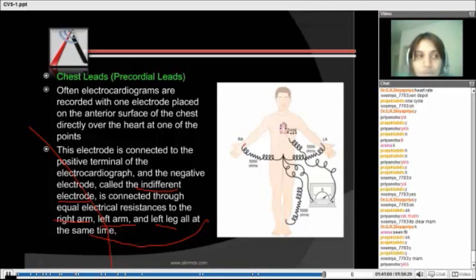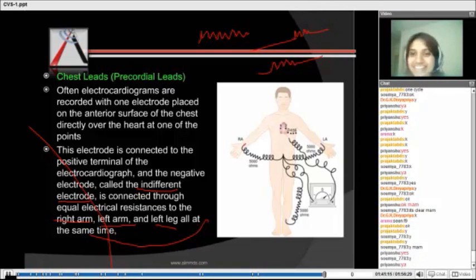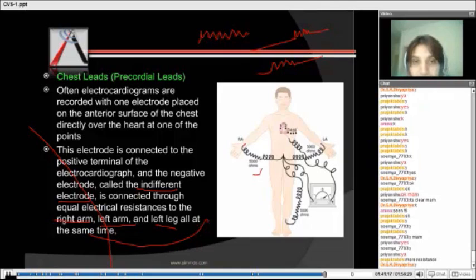What they make sure of is the wire which is used. See the resistance here? If you remember your physics, this indicates the resistance offered by the wire. Yeah, so this resistance is the same. When the 3 wires are connected, the resistance that is applied there is the same. Okay, so that is how you will be able to record point 1.